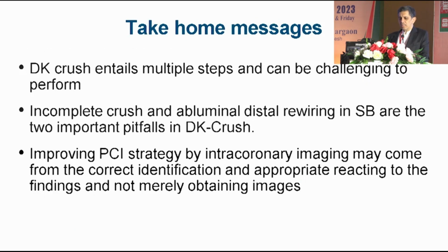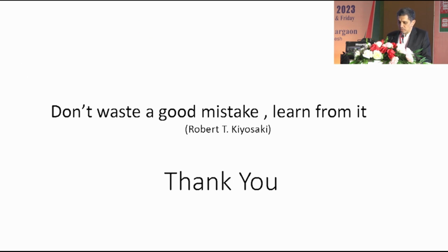So the DK crush entails multiple steps and can be challenging to perform. Incomplete crush and abluminal distal rewiring of the side branch are the two important pitfalls in DK crush. Improving PCI strategy by intracoronary imaging may come from correct identification and appropriate reaction to the findings, and not merely obtaining images. Don't waste a good mistake. Learn from it. Thank you very much.